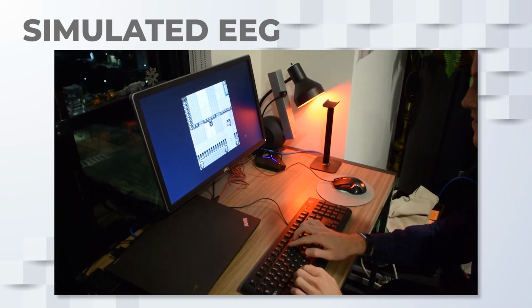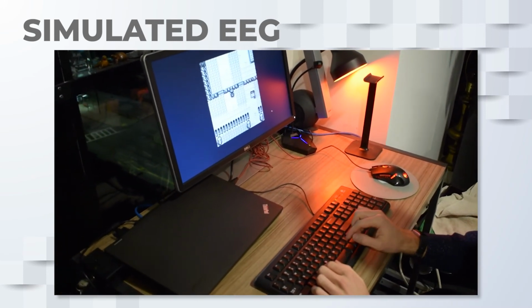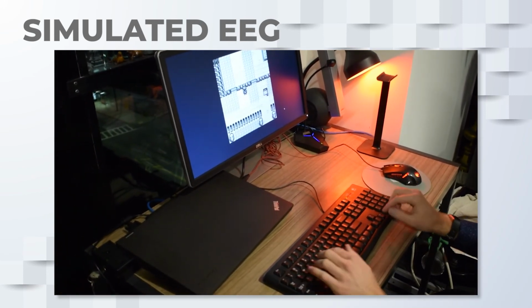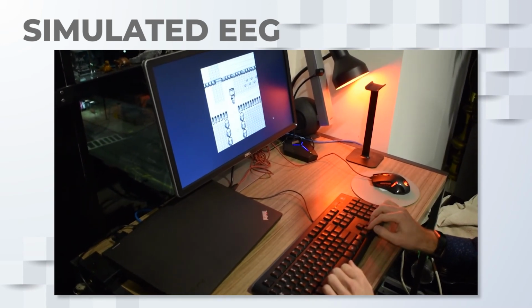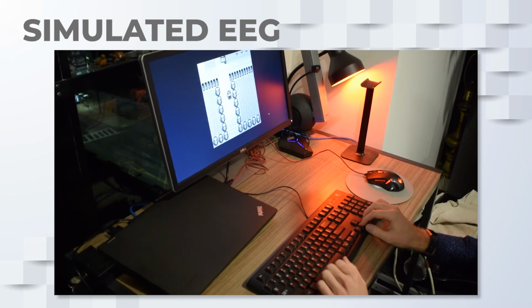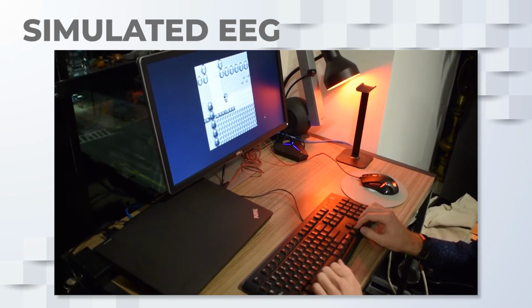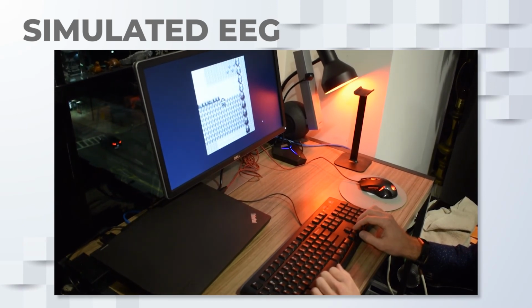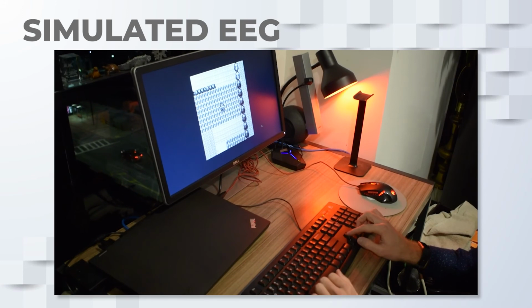Our controls and the order of targets are the A button, B button, up, left, right, down, start, and select. The relatively prime frequencies we used were 43, 37, 29, 21, 17, 11, 8, and 5 Hz. Numbers 1 through 8 represented those buttons, and the arrow keys were also mapped to the same targets as numbers 3, 4, 5, and 6.